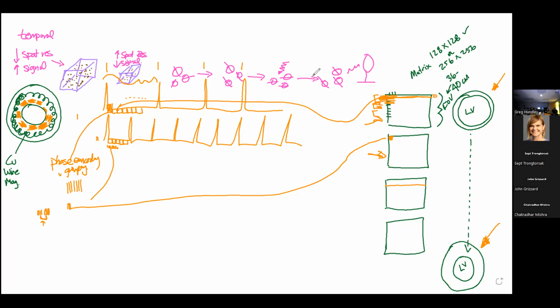So what the technologists have to do, remember, every time we set a scanner, every time we do a scan, we are programming what we're going to do, right? It's not like turn on the echo machine, turn on the fluoro in the cath lab. We're running a computer algorithm. And so the thing you have to understand is that as the heart rate increases, we decrease the phase encoding grouping. But we're okay because the number of times we're going to collect is sped up. Instead of one piece of information every second, we've got multiple pieces of information coming twice as fast. Does everybody get that? That's key. So fast heart rates, less phase encoding grouping. But we're okay to fit it in a breath hold because the heart rate's twice as fast.